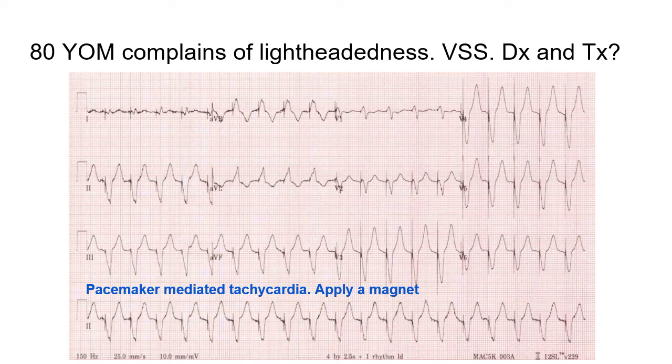The treatment would be a magnet will reset that to the factory settings. So.